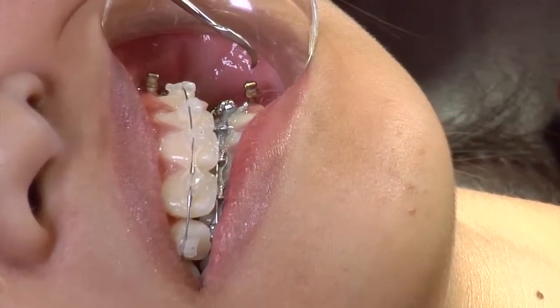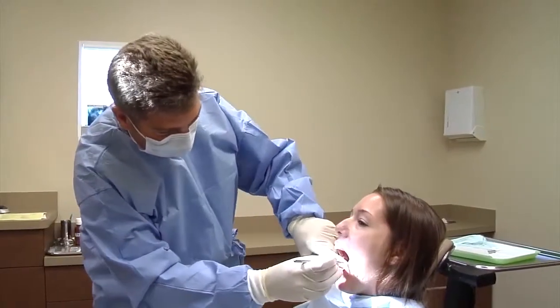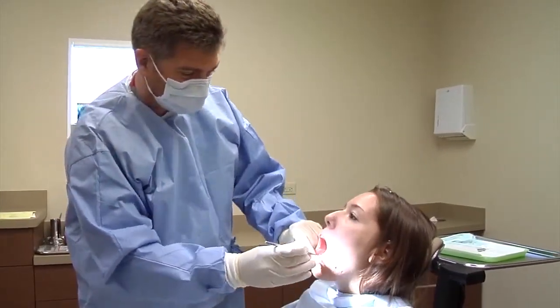Insertion of a TAD is usually a team effort, involving both your orthodontist and an oral and maxillofacial surgeon. Your orthodontist will refer you to a surgeon who will meet with you to evaluate your individual situation, discuss the procedure, perform certain diagnostic tests, and schedule the surgery.